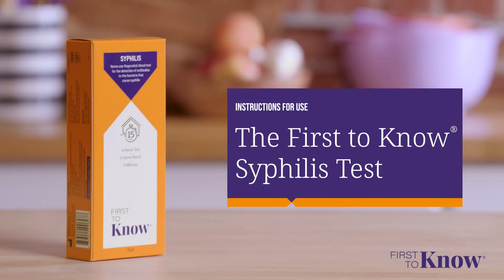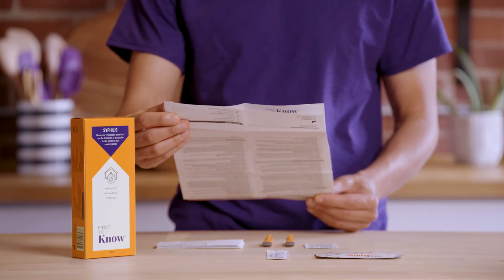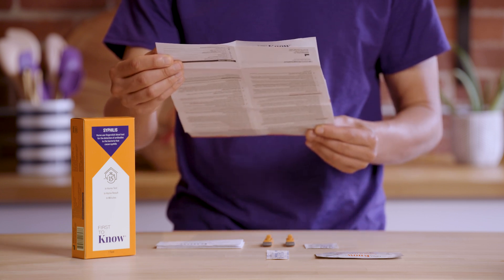The First to Know Syphilis Test provides in-home results in just 15 minutes. Welcome to the instructional video for the First to Know Syphilis Test. This video will guide you through the steps to correctly prepare for the test, use the test, and understand the results.